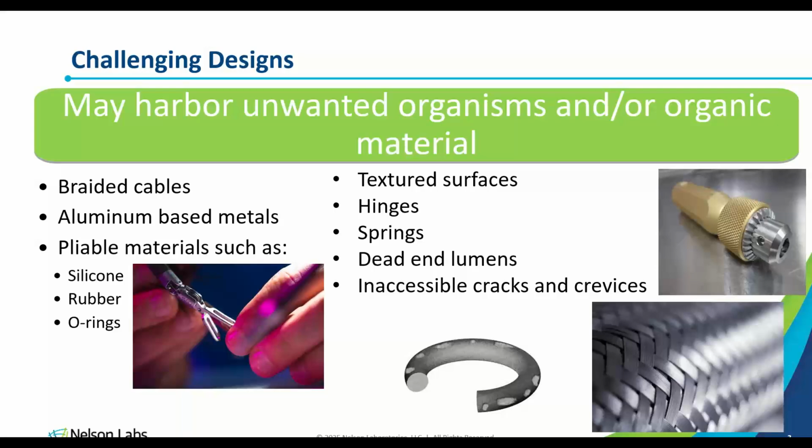The important part is with cleaning validations, we do apply a correction factor based off that recovery efficiency. So even if it's below 70%, we're still taking into account that recovery efficiency into the test articles and the negative device controls. It's still taken into account with those results. So I don't think it necessitates a retest right away. If you're below 70%, I would just investigate it a little bit.